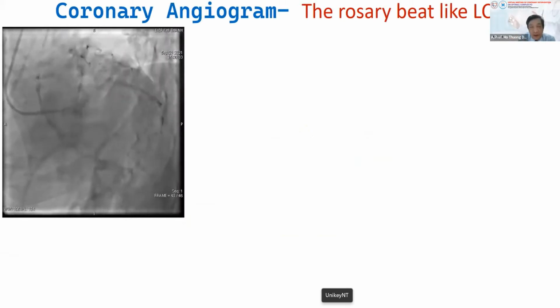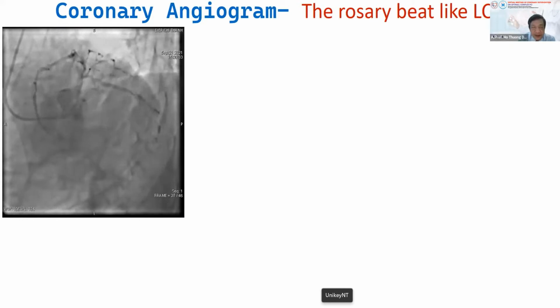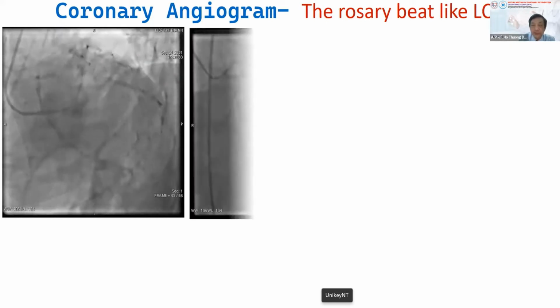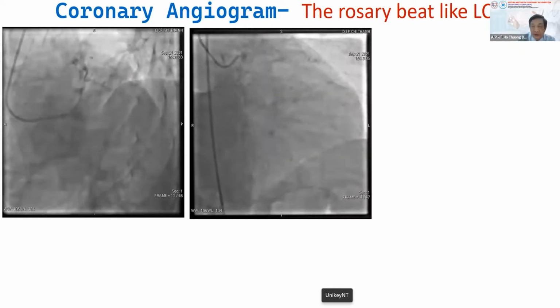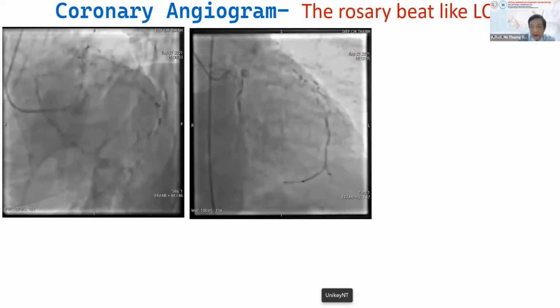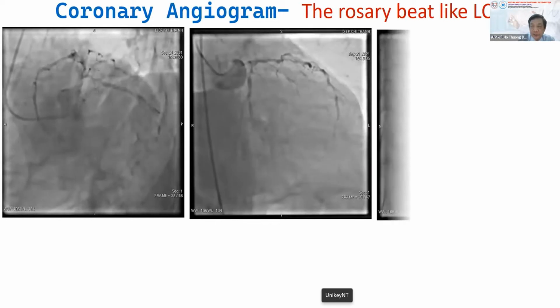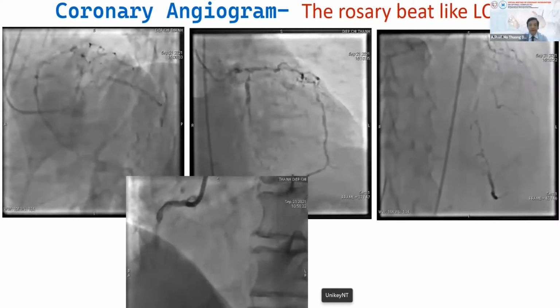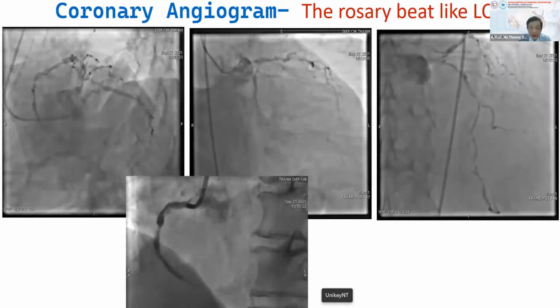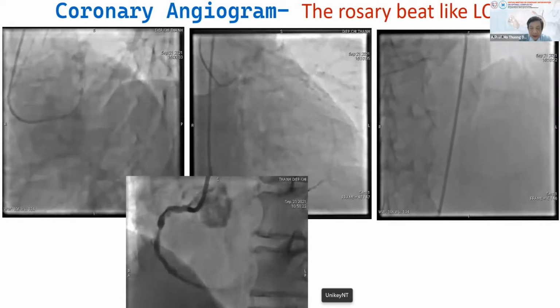This is the left coronary artery. We can see left main heavy calcified lesion, distal left main involved to both ostium and proximal of LAD and circumflex. And long diffuse lesion along the LAD. On the right, very calcified proximal and mid segment of RCA.